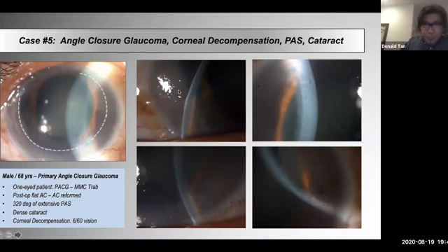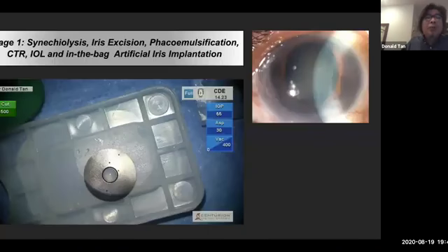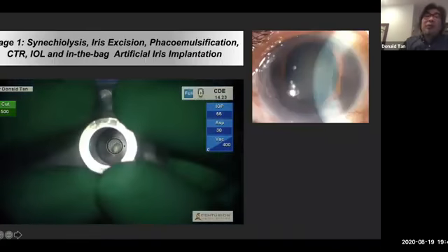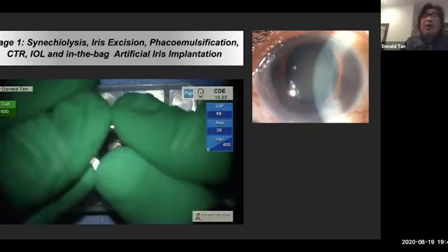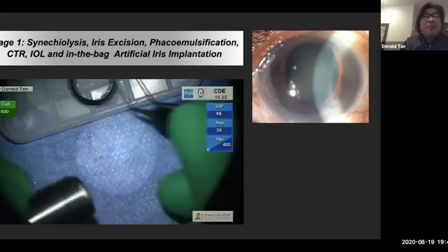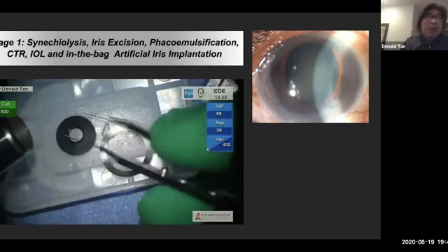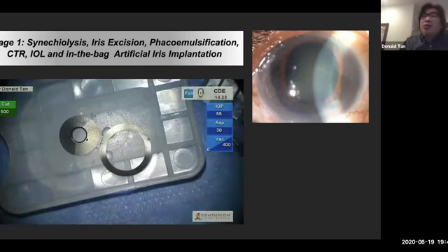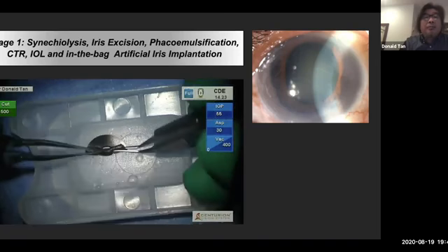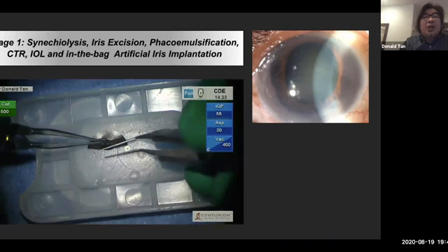Okay, so I managed to convince the patient that he didn't need this iris anymore. Here was a different technique. The capsule, if it was intact with my phaco, then I would put it in the bag. And here we're trimming slightly smaller diameter. No sutures now. I still had the fiber version. You can use the non-fiber, but this, I'm rolling it up and going to insert it in an IOL cartridge.